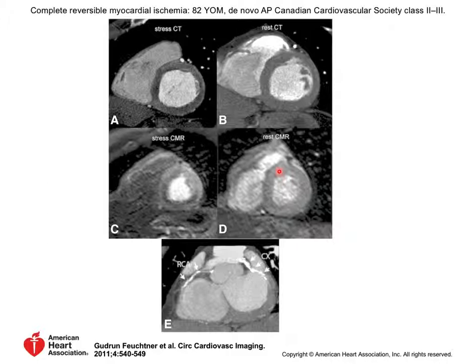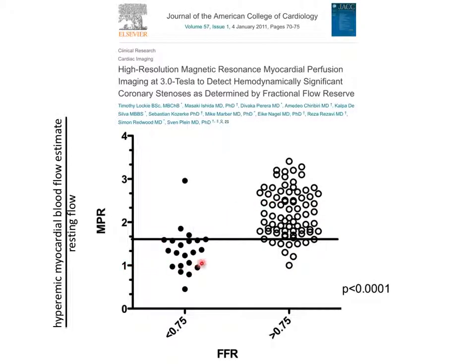Right? In this patient, that ratio here is less than 1, right? In this location, because it looks like it almost got darker than this tissue. Okay, so if it's less than 1, that's a big problem. The patient, their flow actually goes down during stress. So you can see here's 1, so there's a group of patients in which you got a dark response on the MR.